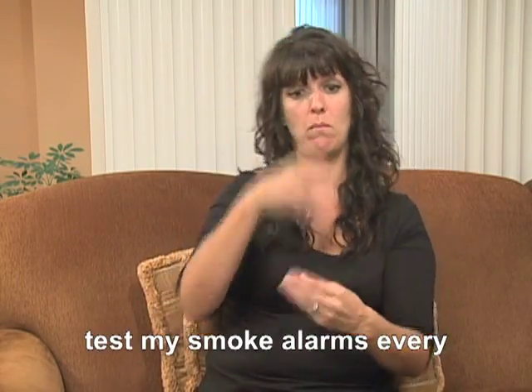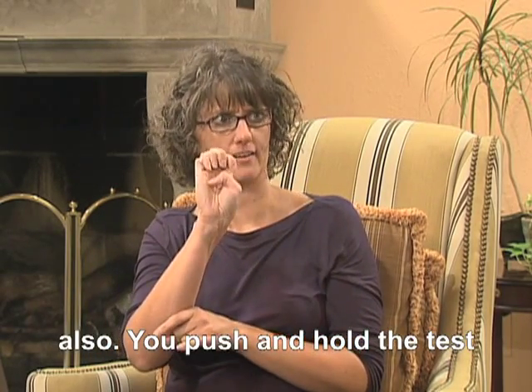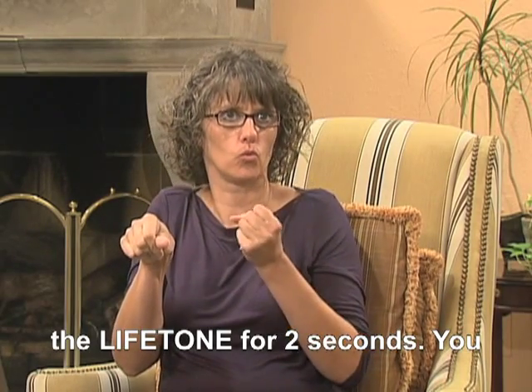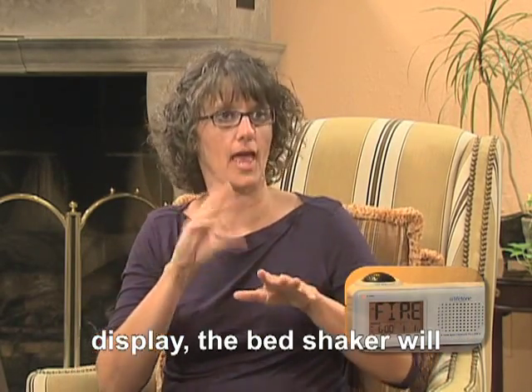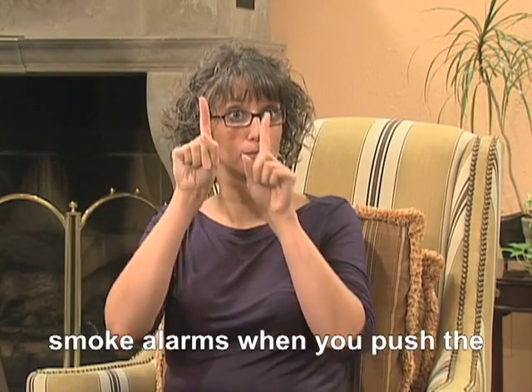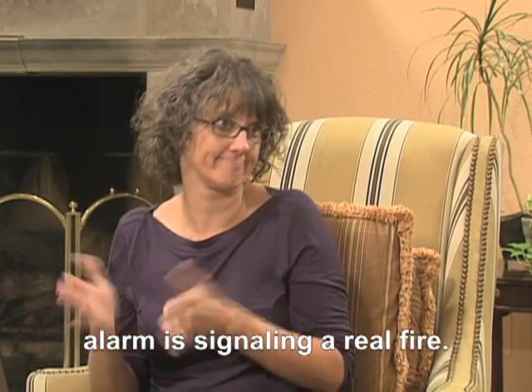I know to test my smoke alarms every month. When do I test my Lifetone? When you test your smoke alarm, test your Lifetone also. You push and hold the test or silence button on the back of the Lifetone for two seconds. You will see the word fire on the display. The bed shaker will shake and the loud low sound will be made. The Lifetone will not respond or alert to your smoke alarms when you push the test button on the smoke alarms. The Lifetone is smart — it knows the difference between a smoke alarm test and when the smoke alarm is signaling a real fire.